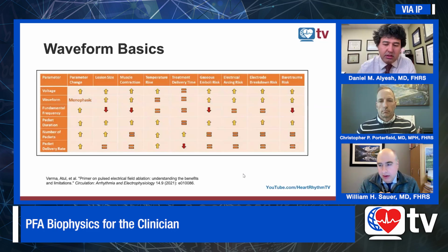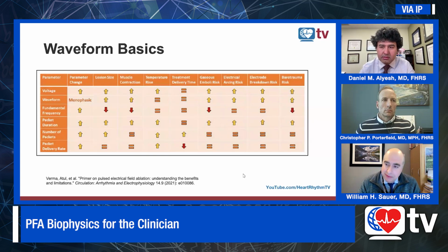Yeah, I agree. With radio frequency energy, there's preclinical evidence that got us to the 450 kilohertz number, and we rely on that. It's a similar analogy here, where we rely on a proprietary waveform or sequence, and then we trust, based on the clinical evidence, the safety and efficacy of the tools that we're given. But I'm with you. I want to learn more about it. Can I tweak it? There's an engineer in me where I feel like I've got to make it right for the patient. Chris, what do you think?